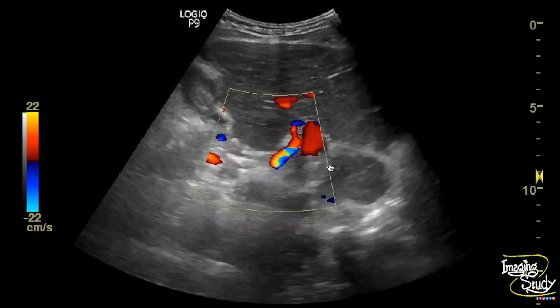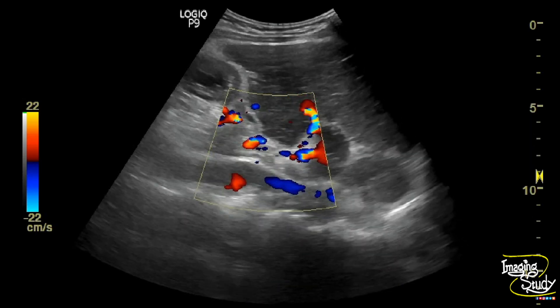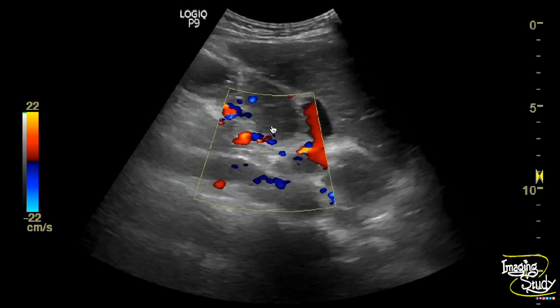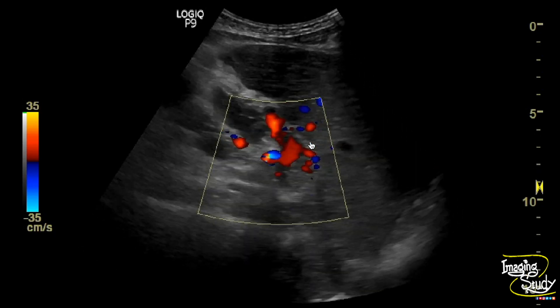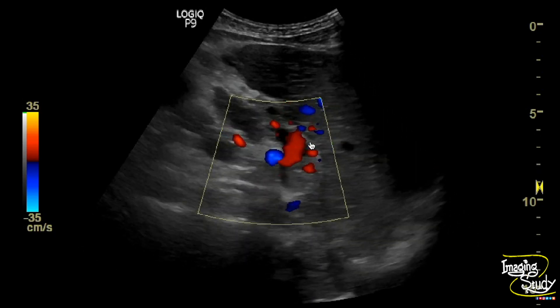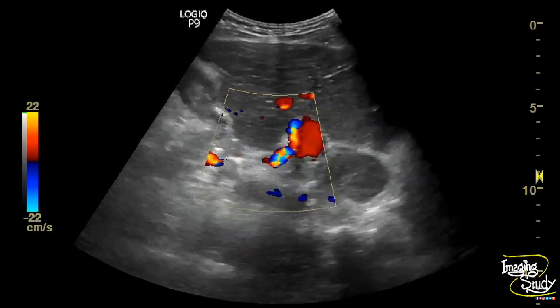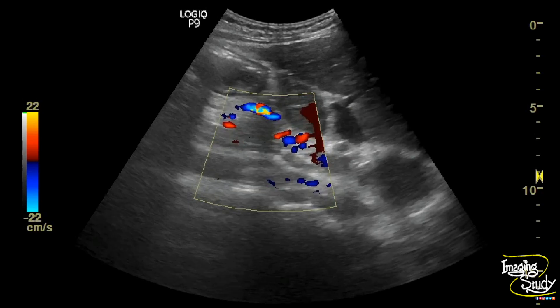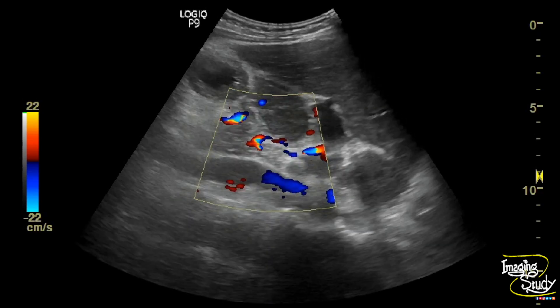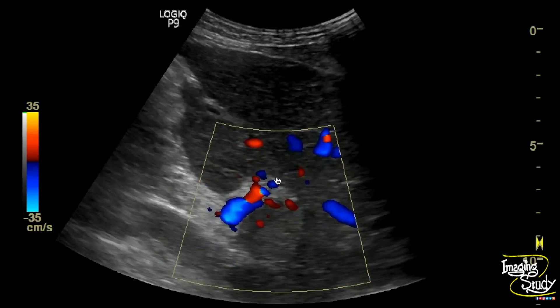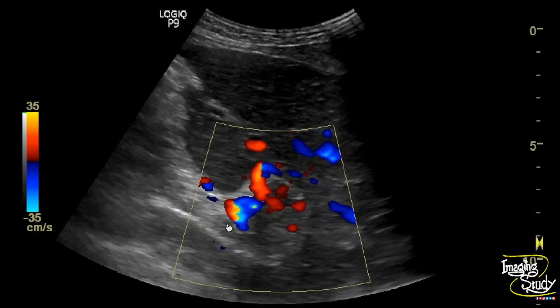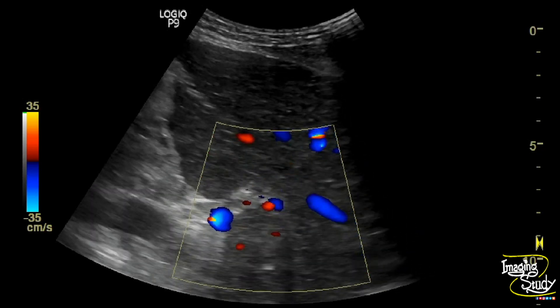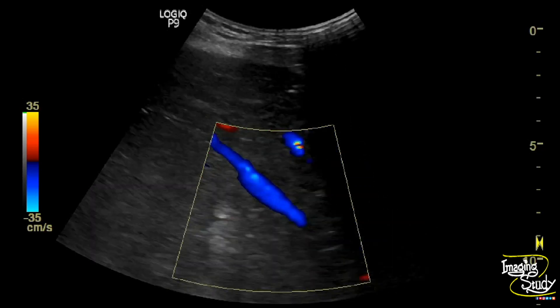Now the question arises: how does this blood flow through? You can see some tortuous vessels adjacent to the thrombosed portal vein, which indicates cavernous transformation. The hepatic artery and irregular tortuous vessels adjacent to the thrombosed portal vein further confirm cavernous transformation.